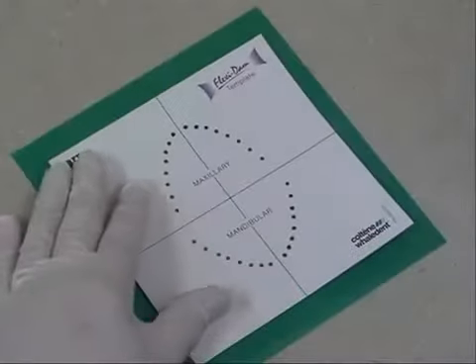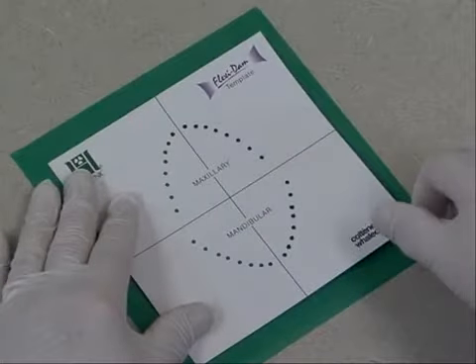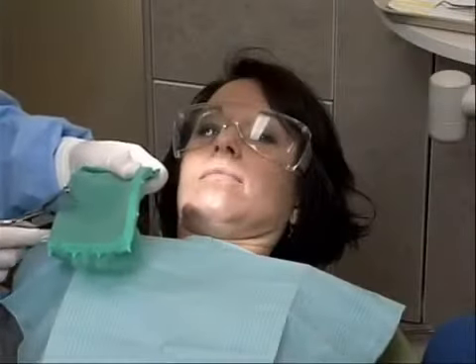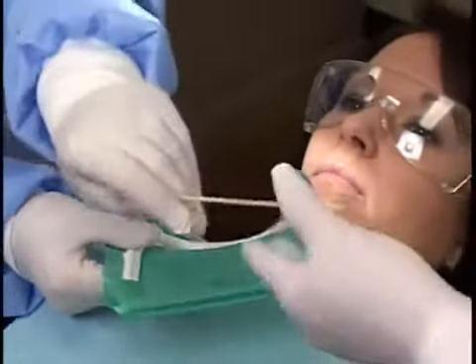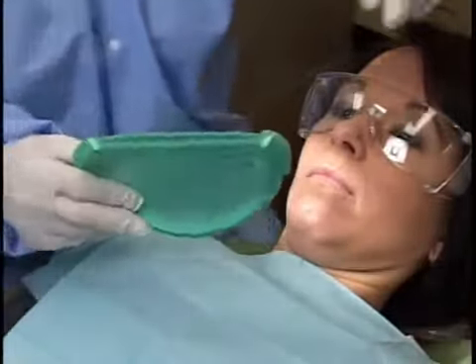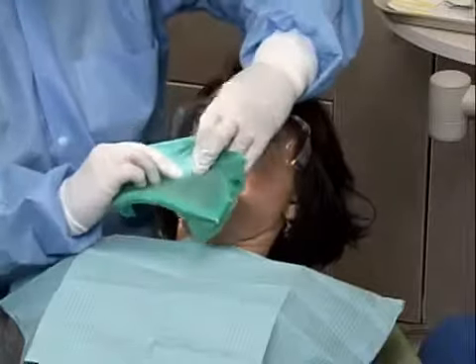Mark the anchor tooth hole using the template if necessary. Place the dam on the frame and then punch the hole. Place water-soluble lubricant on the tissue side of the dam to facilitate placement of the dam over the anchor tooth.